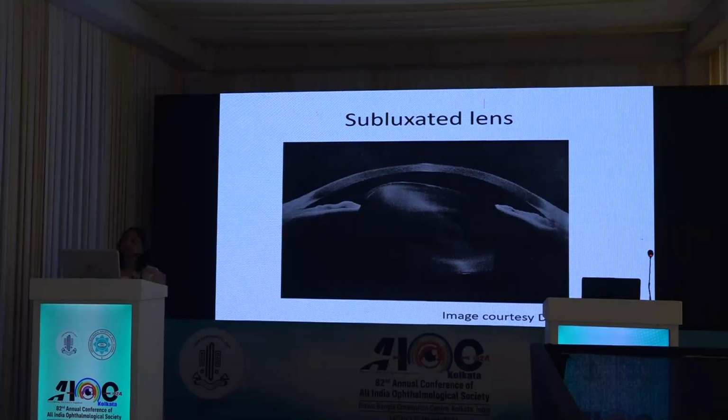Now, all these pictures that I had shown earlier were taken on the retinal systems converted from the retinal scanners. Now, this one is a dedicated anterior segment OCT system, Anterior. You can visualize almost the whole of the anterior segment. It's beautifully shown, a very nicely shown subluxated cataract with a tilt and irregular anterior chamber depth.